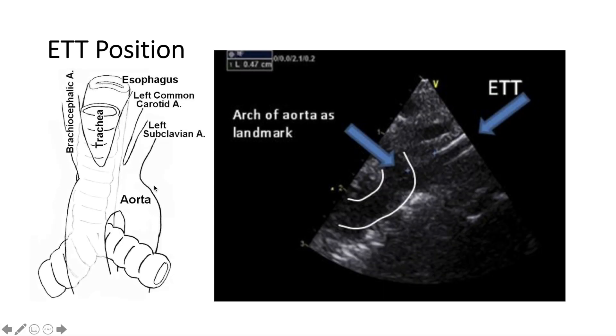ETT position can also be assessed using ultrasound. It's based on the fact that the aortic arch is above the left main stem. The ET tube comes down the trachea, and it should be above the aorta by about one to two centimeters — that's the distance between the tip of the ET tube and the arch. More than that means a high ET tube; less than that means a deep ET tube.